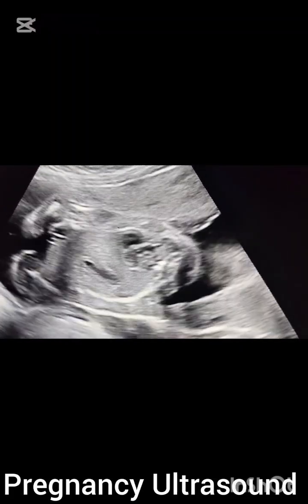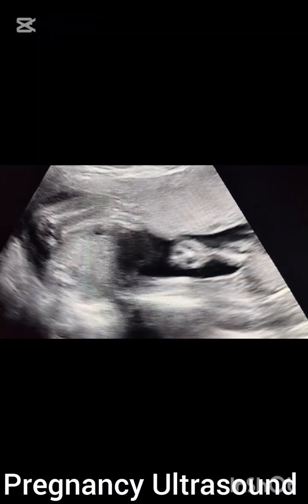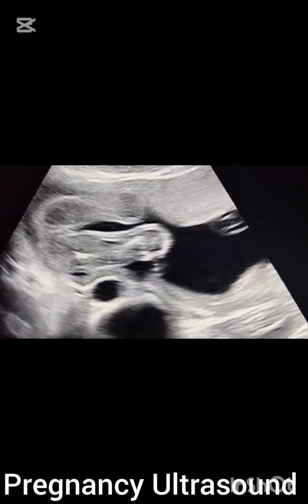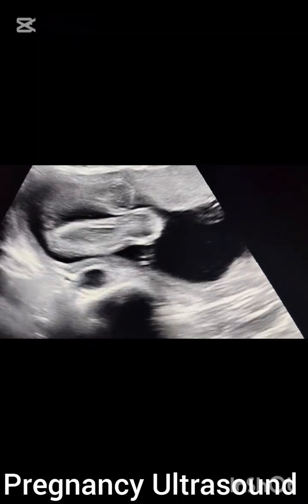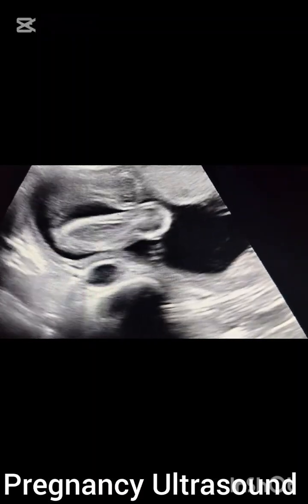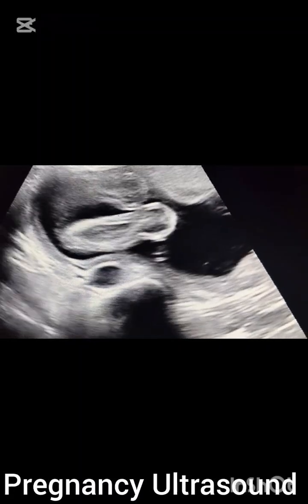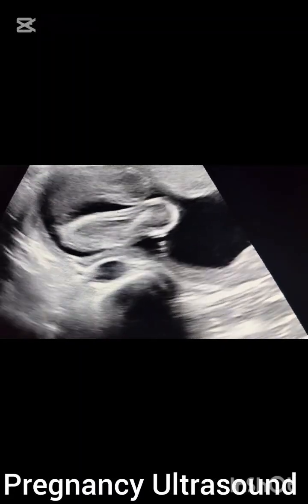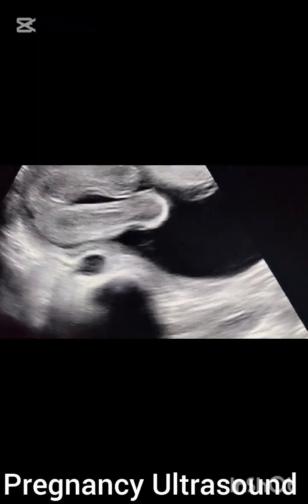Cardiac activity is present. Placenta is anterior and liquor is adequate. So basically, what do we need to see during the pregnancy ultrasound? First of all, we see whether it is a single or twin pregnancy — we comment on the number of fetuses.